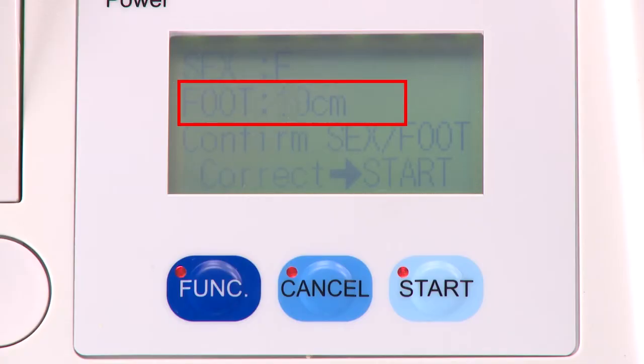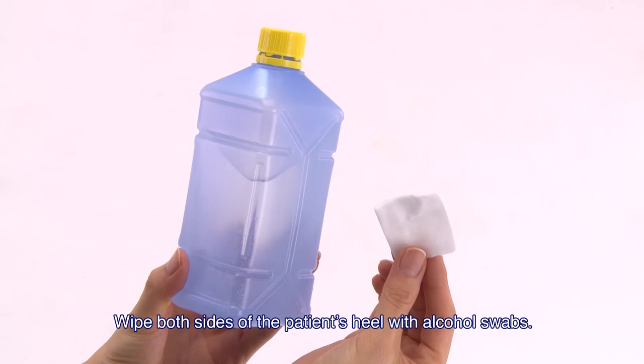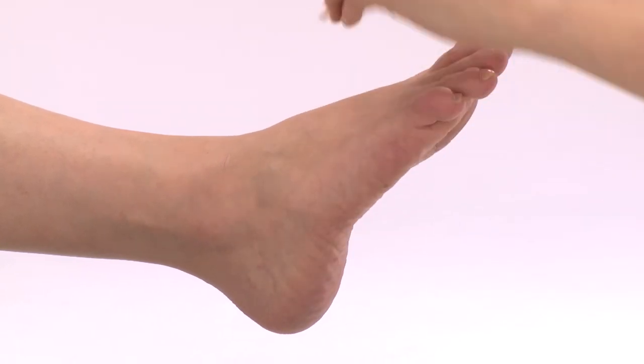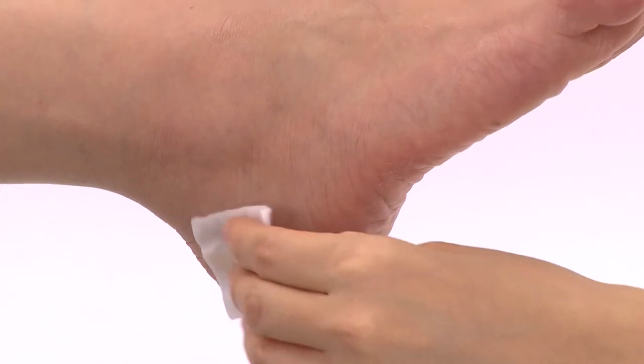Turn the foot size dial to adjust to the patient's foot size. Sizes are displayed in 5 steps on the screen. Select the correct size for the patient's foot size. Wipe both sides of the patient's heel with alcohol swabs.